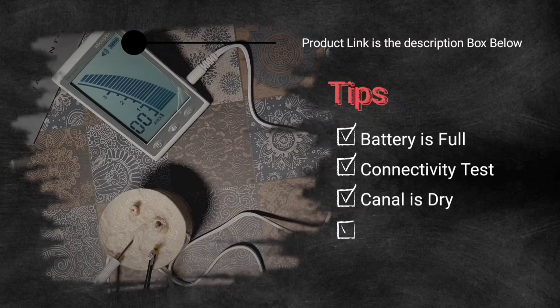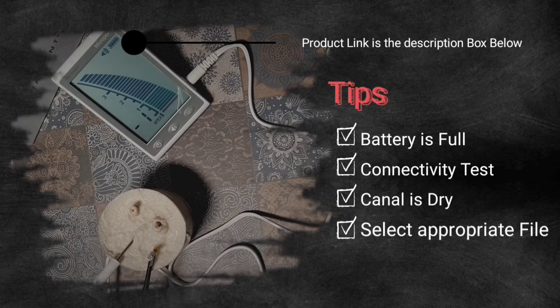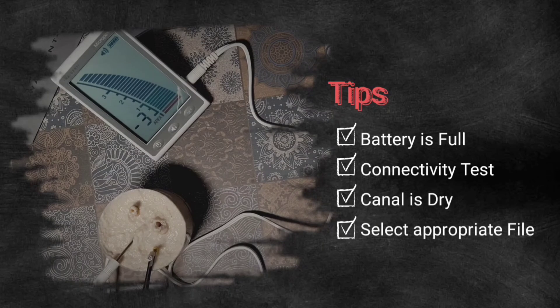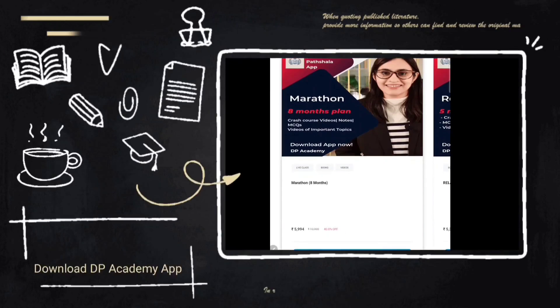In summary, the tips for using an apex locator are: check the battery, do a connectivity test before use, ensure the canal is dry, and select the appropriate file size. For more dental information, download the DP Academy app now.